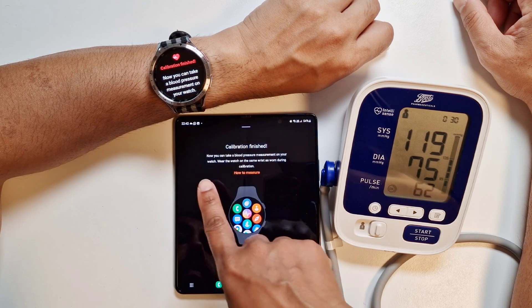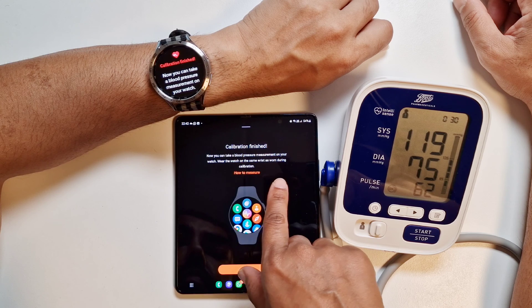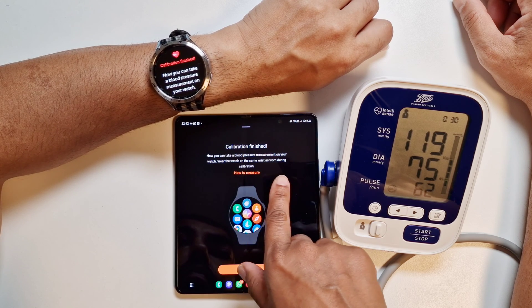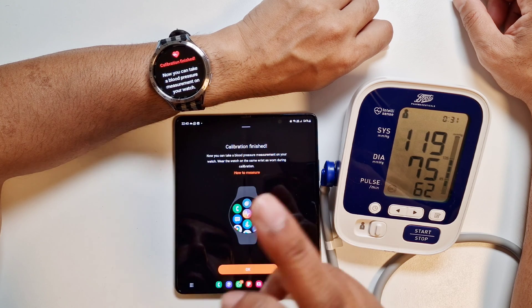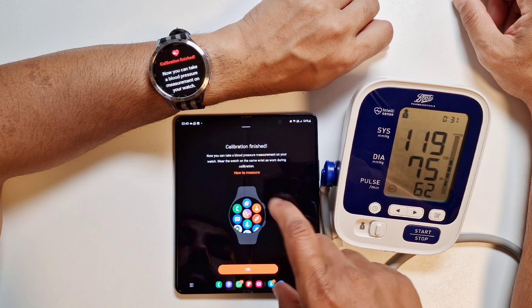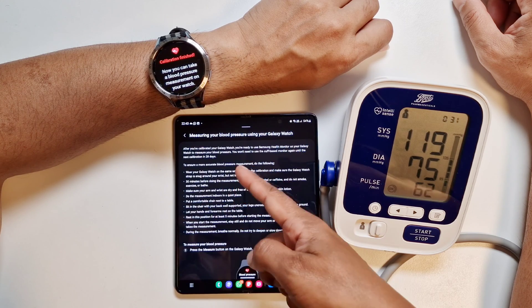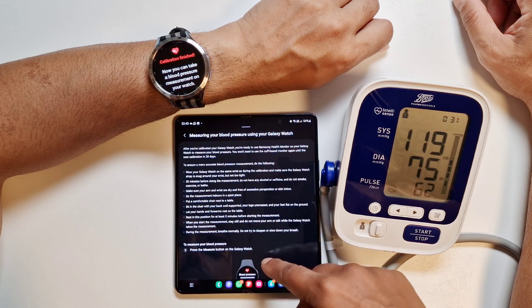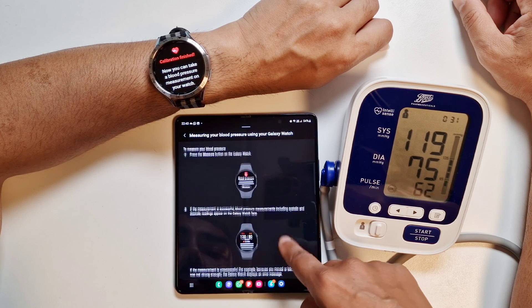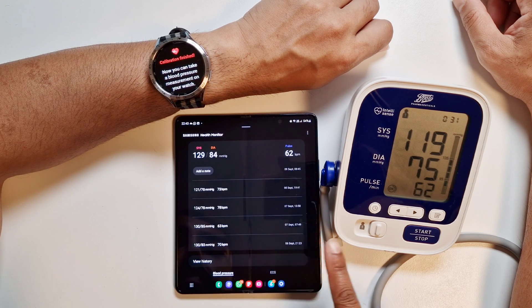The phone is telling us calibration is complete. Now you can take blood pressure measurements on your watch. Wear the watch on the same wrist as worn during the calibration. To take your blood pressure measurement you can only use your left hand because that's the hand used to calibrate the watch. The app shows instructions on how to measure — it's quite detailed, so do read through. Calibration is finished.